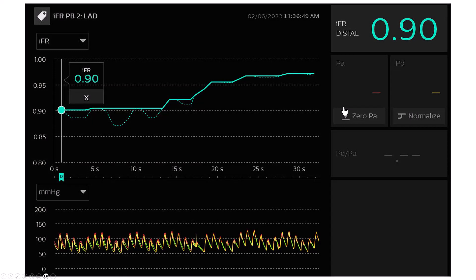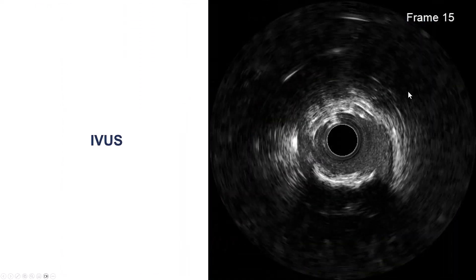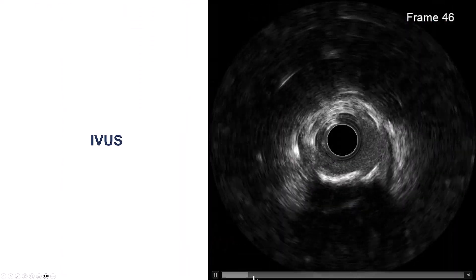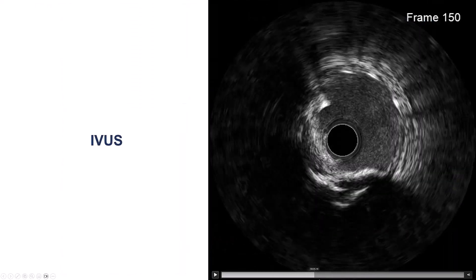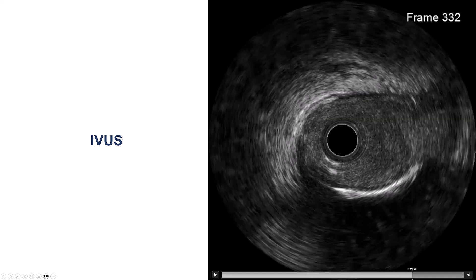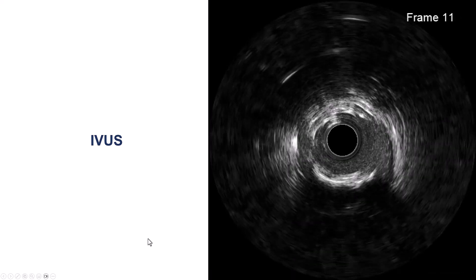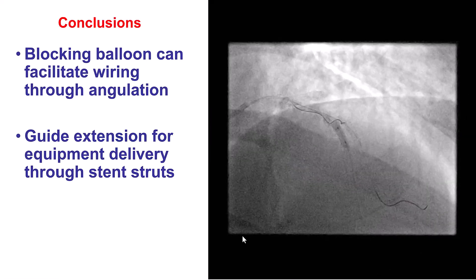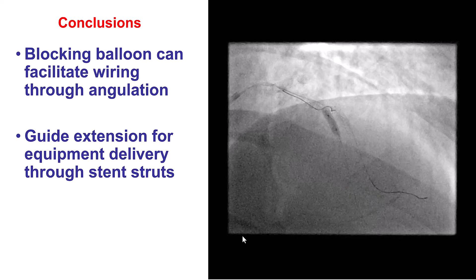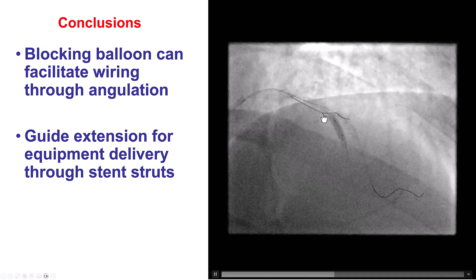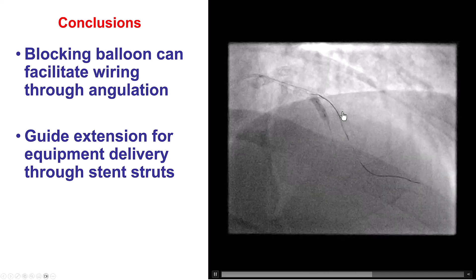We were able to do the kissing balloon inflation. We did repeat coronary physiology, and now the IFR had significantly improved. There was a slight step-up, but it was 0.90. We did intravascular ultrasound, which showed good expansion of the stent, and again there was no significant disease in the left main. In summary, this case illustrates use of the blocking balloon for advancing a guide wire into a side branch.